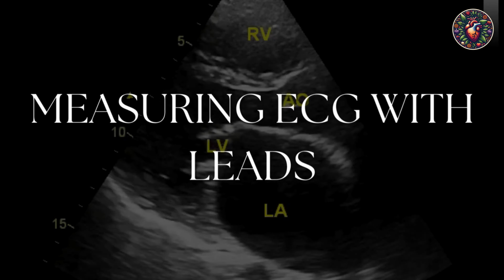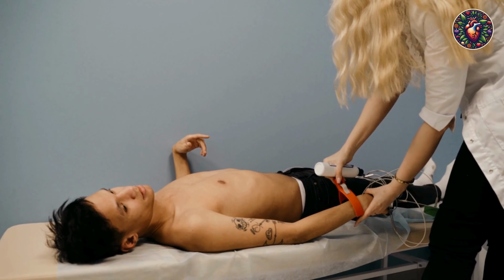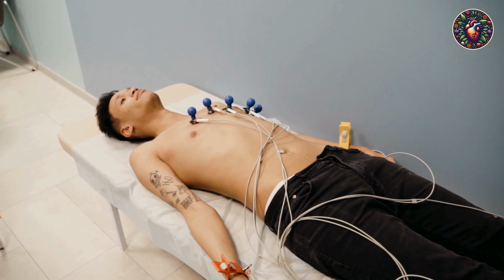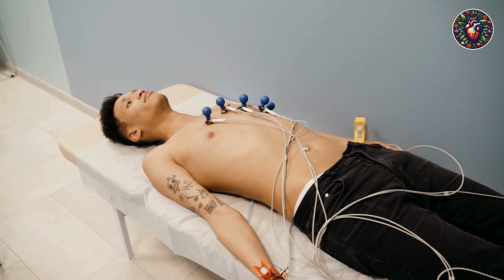Measuring ECG with leads. To measure an ECG, we use leads, which are attached to an ECG monitor. There are typically 3 to 12 leads used, depending on how detailed the reading needs to be. The most common method for a comprehensive reading is the 12-lead ECG, which provides a more in-depth view of the heart's electrical activity. However, for a simpler, basic ECG, a 3-lead ECG is also commonly used.